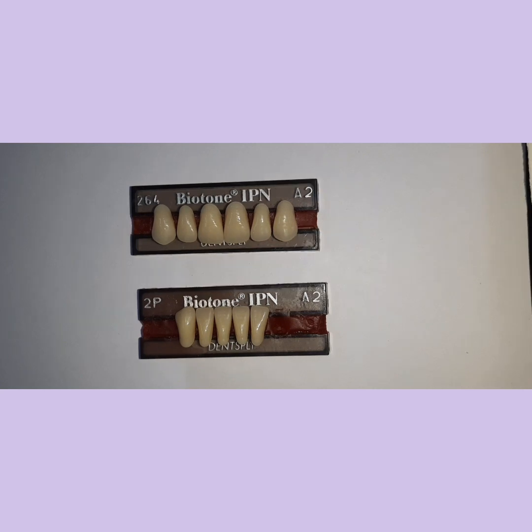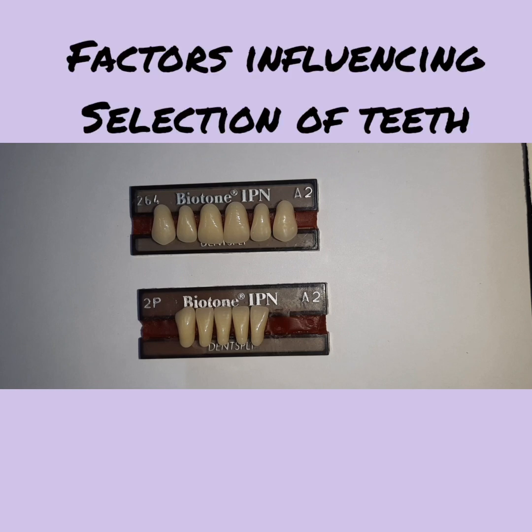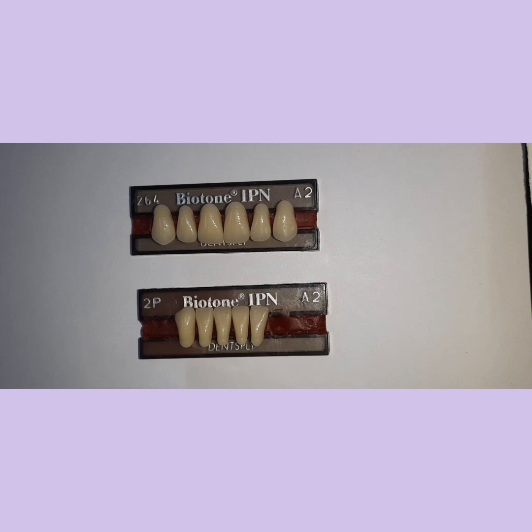Next, now what are the factors which help in selection of anterior teeth? Primarily, there are three factors. One is size of the teeth, form of the teeth, and the color of the teeth. First, the size of the teeth.